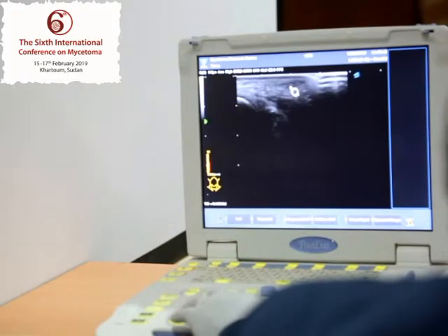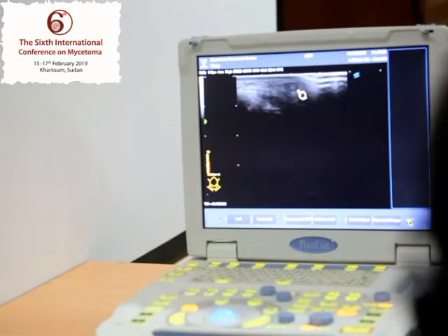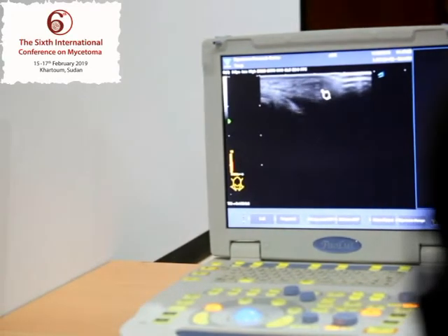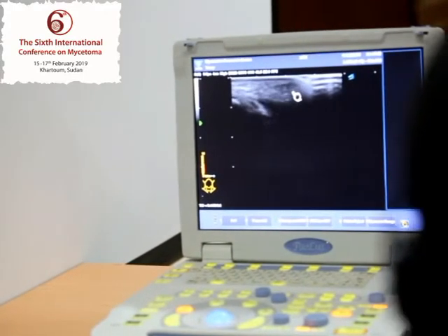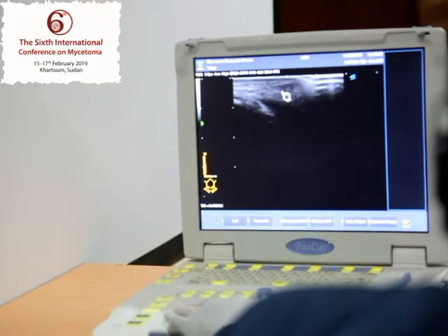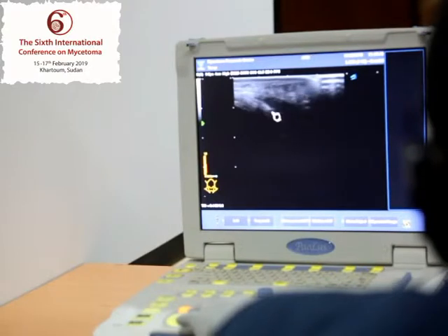This sharp echogenicity and the size of grains, which is around 2 to 5 millimeters, is in keeping with, or directs to, the line of eumycetoma. As you can all see, this lesion is confined to the subcutaneous area. It hasn't any deeper extension to the tendon, and it hasn't deeper extension to the bone. So this is a very early disease.